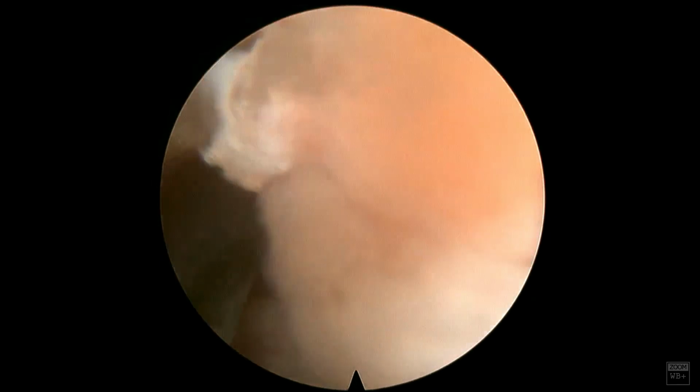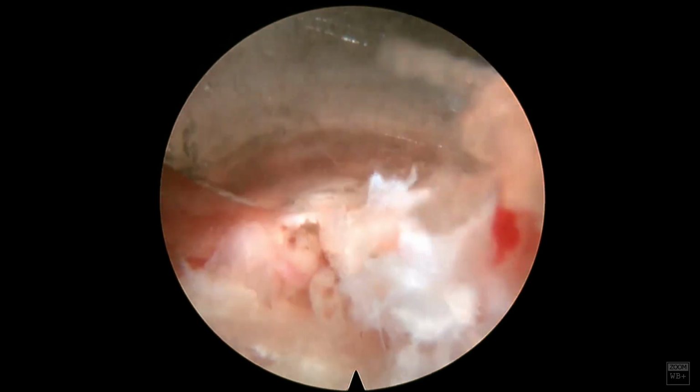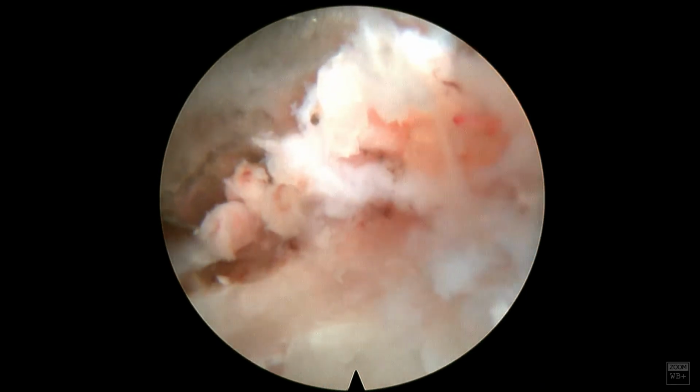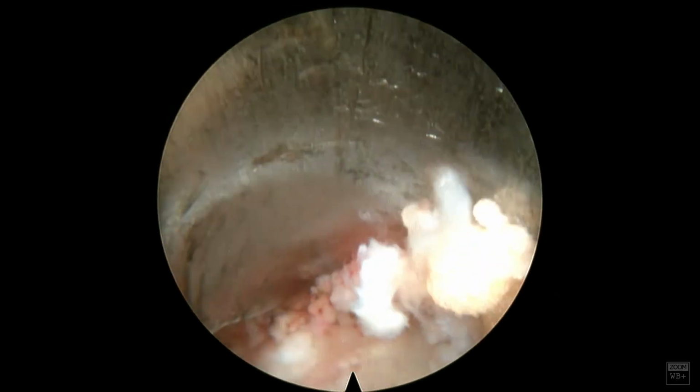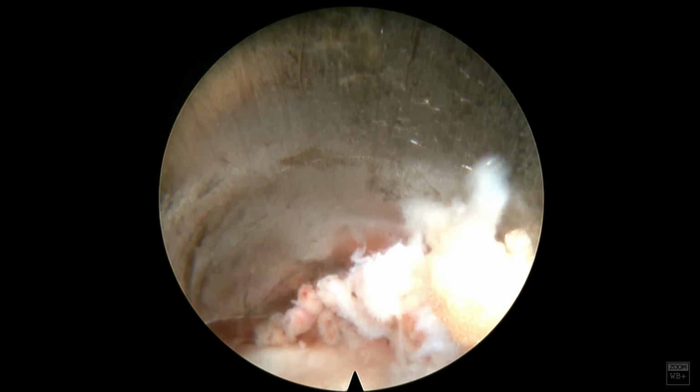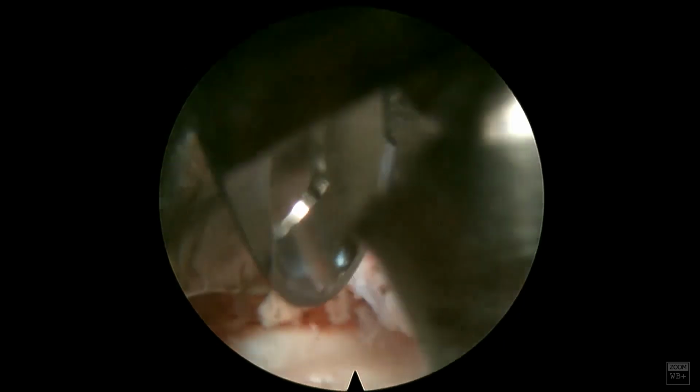I didn't want to go the other way, so I'm coming back this way because I don't want to squish the L5 nerve or compress it. I guess squish is a medical term. But the L5 nerve can sometimes be very tenuous, and so I don't want to push on it too much. Again, this is just an experience feeling on how much to retract a nerve root. I'll use a pituitary to remove that little bit of disc there.